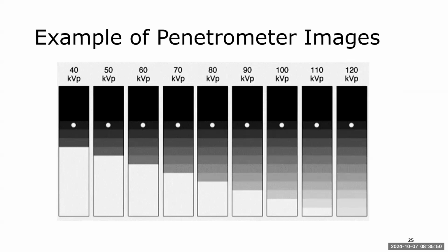So this is just an example of what's called a penetrometer. We used to use them a lot to help prove and demonstrate these things, but not so much anymore. But I can show you one in lab. I believe I brought one over.